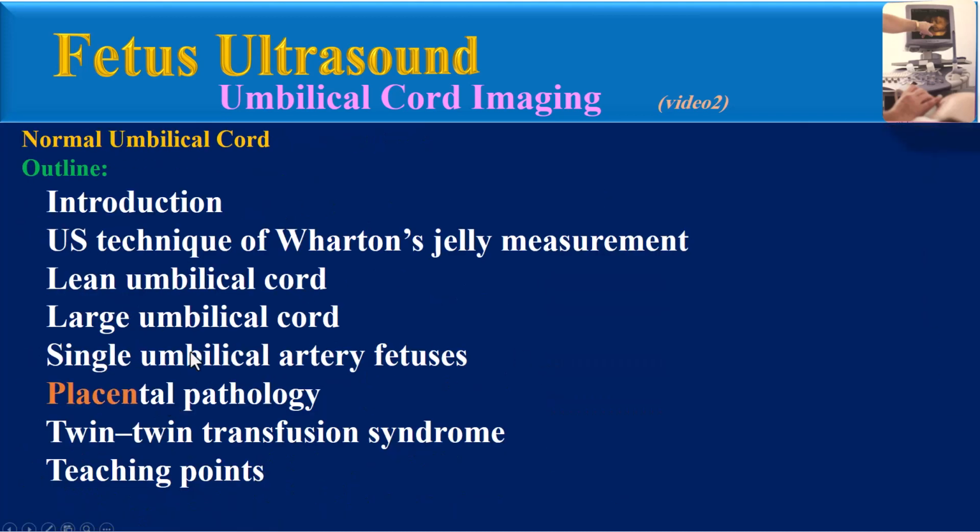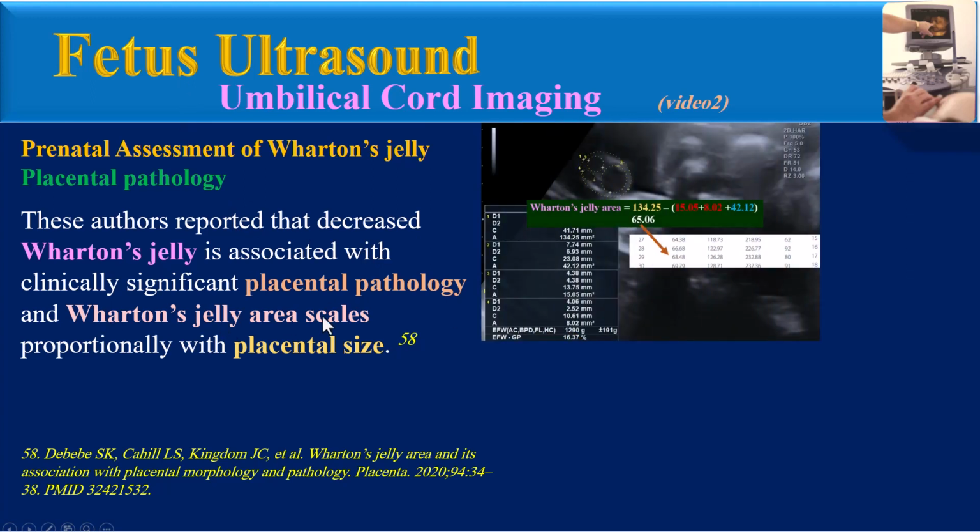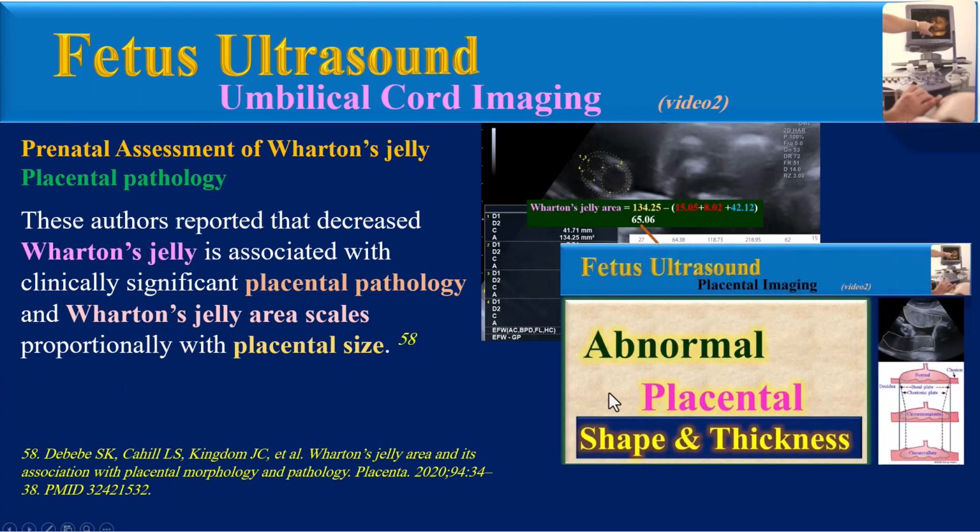The correlation of Wharton jelly measurement and placental pathology. This study reported that decreased Wharton jelly is associated with clinically significant placental pathology and Wharton jelly area scales proportionally with placental size. You can find full explanation about abnormal placental shape and thickness in this video.